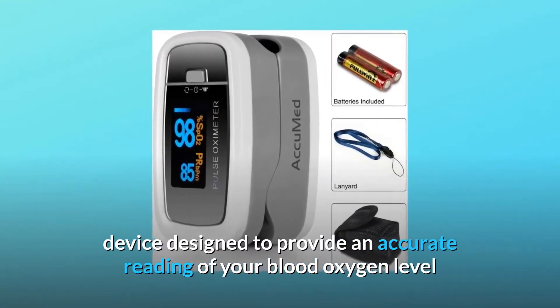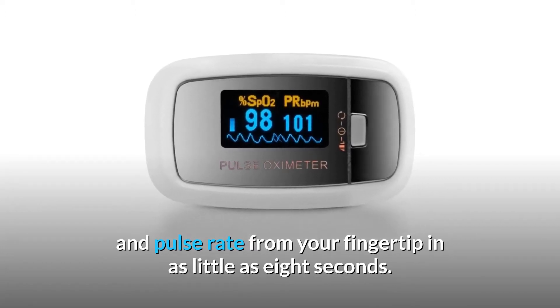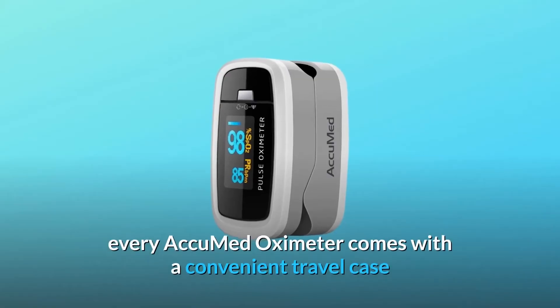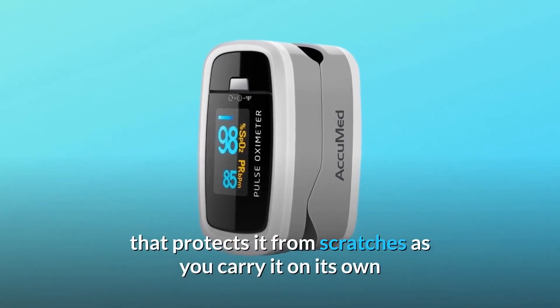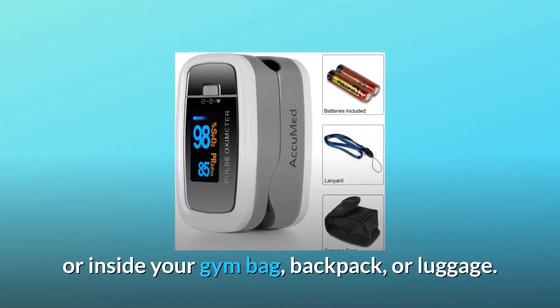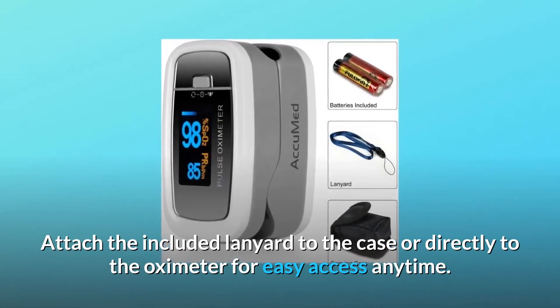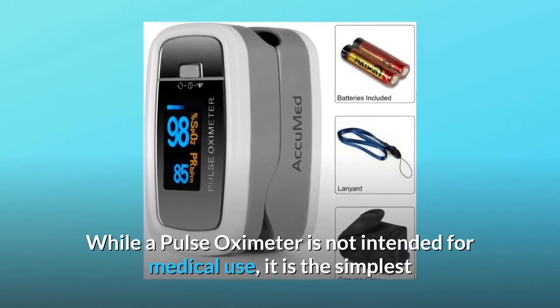The AccuMed oximeter delivers readings in as little as eight seconds. Weighing only 50 grams with batteries included, every AccuMed oximeter comes with a convenient travel case that protects it from scratches as you carry it on its own or inside your gym bag, backpack, or luggage. Attach the included lanyard to the case or directly to the oximeter for easy access anytime.